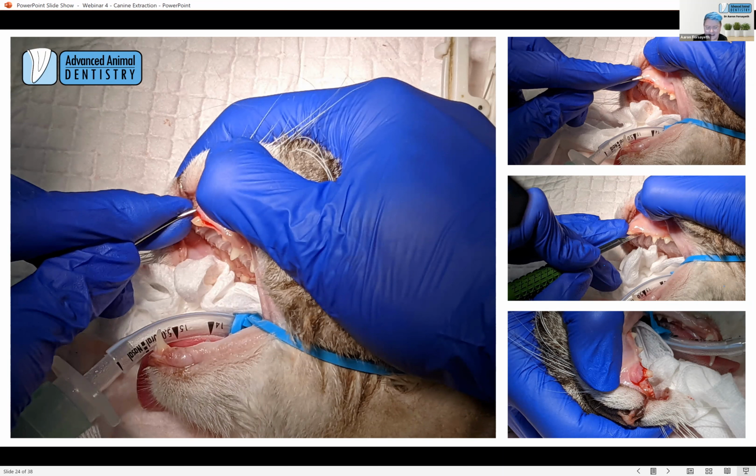You just got to take it easy and take a little bit at a time, lift a little bit at a time, because again, we're dealing with paper here. So tearing it is just frustrating. It can be solved. You can recreate a flap from further up in the lip for sure. But if we can avoid that, that would be better for everyone's blood pressure.